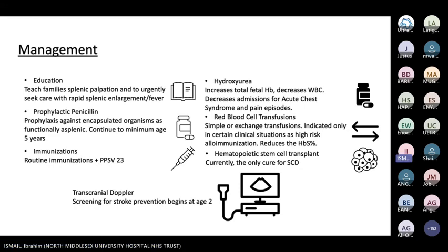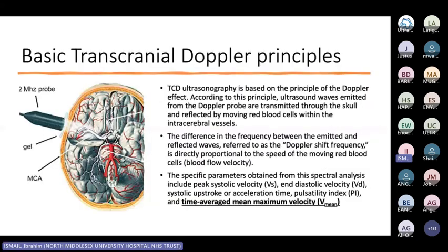And the only so-called cure for SCD is a stem cell transplant. But we maintain our patients and commonly screen them using transcranial Doppler, which we get on here. So, basic transcranial Doppler principles.